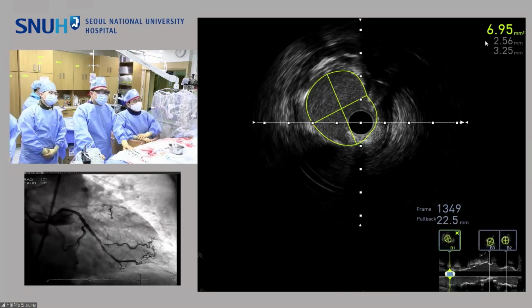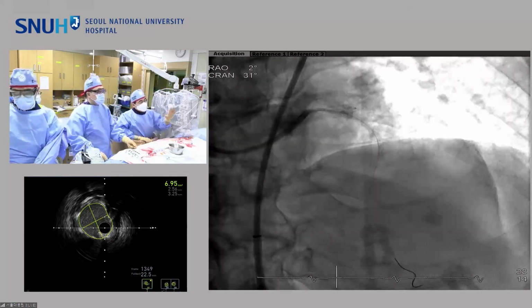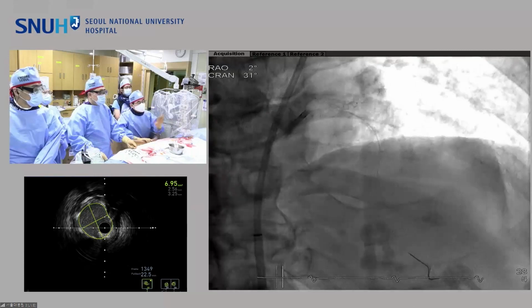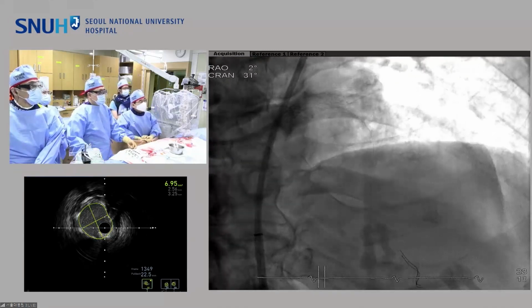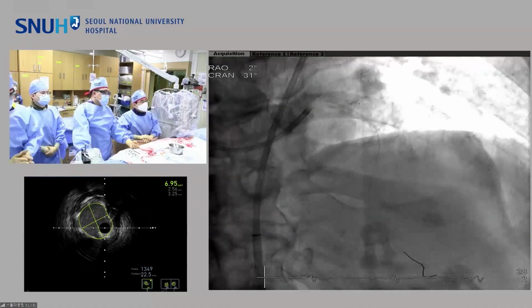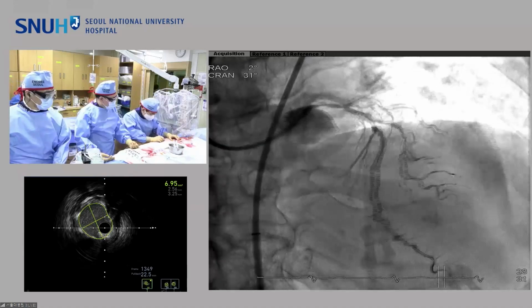So we changed to the primary target of proximal calcified lesion. Okay, once again. When we use lithotripsy, we have to pass the balloon and inflate because the deliverability of lithotripsy is not so excellent. So if the segment is long, if we inflate the balloon and the lithotripsy balloon is passable, then we can do the lithotripsy. It is not available in Korea. The company expected a really expensive price that cannot be reimbursed by insurance. Thus, it is now under situation of negotiation. You would never be able to pass the lithotripsy balloon past this anyway, so you'd never get past that distal lesion.